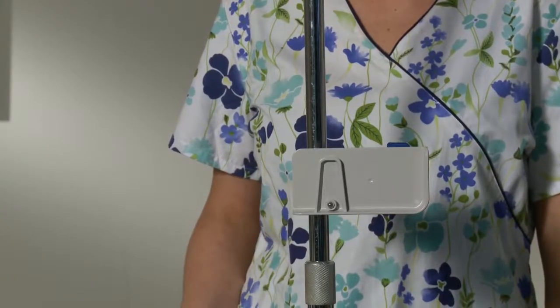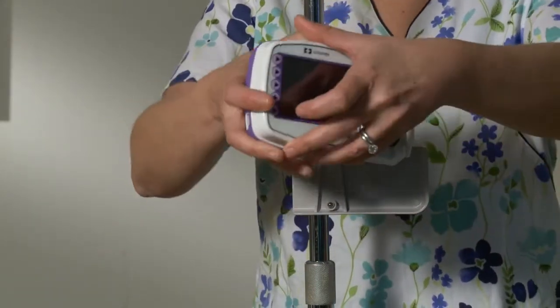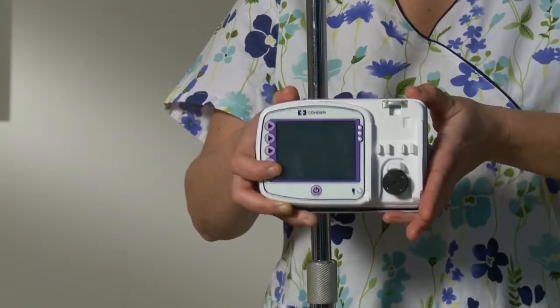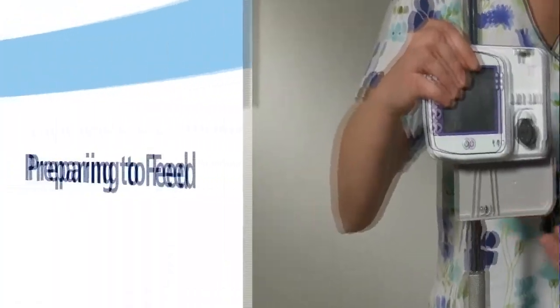Rotate the latch plate connector to look like an upside-down letter U. Match the U on the back of the pump with the pole clamp latch plate and slide the pump down until it has been properly seated. To remove the pump, gently pull upward on the pump until it pops upward off the latch plate.